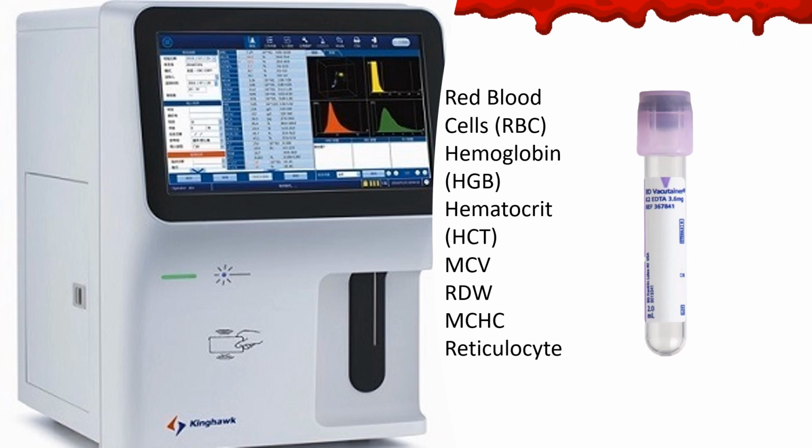That I just cannot react to a specific blood test to treat any patient clinically right away or to manage that patient right away. But also, we need to take into consideration the pre-examination or the pre-analytical errors. Listen, if the person that is taking the blood shakes that tube, you're going to cause hemolysis. It means the breakdown of red blood cells. It means that the red blood cell count is going to decrease falsely, that the hemoglobin is going to decrease falsely. And that is not positive for you, right?